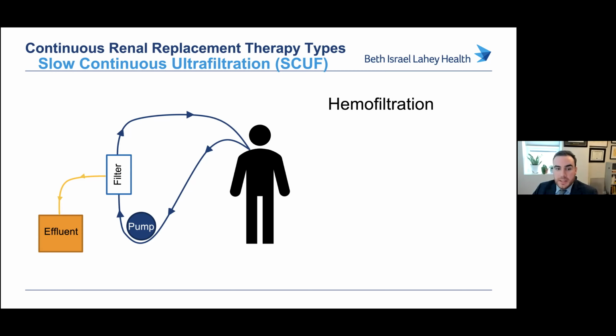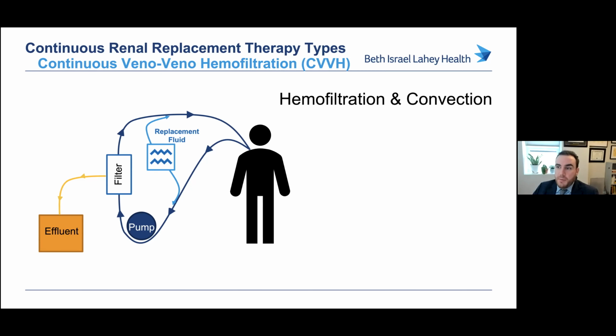The next that we're most familiar with and Leahy uses is the principle of CVVH. CVVH uses the principles of hemofiltration and convection to take both solutes out of the bloodstream as well as to take fluid off.